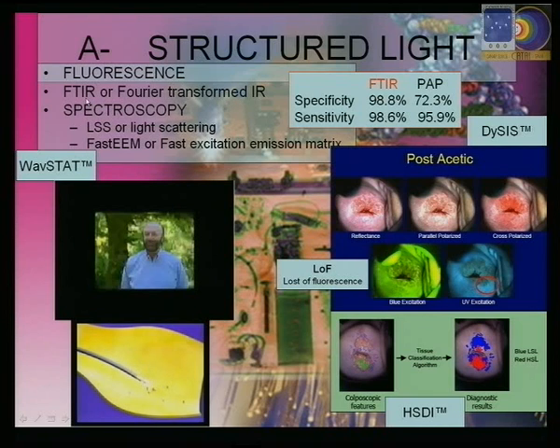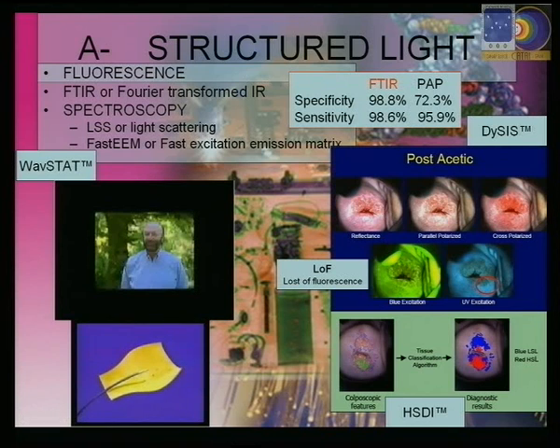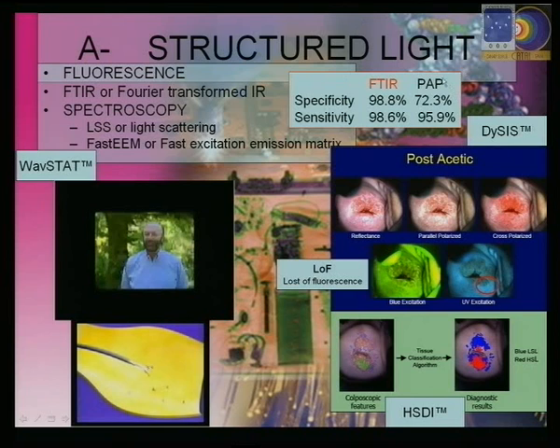This is a very classical use of spectroscopy for detecting malignant areas, and in the cervix and in the bladder and in the colon it does give better specificity and sensitivity than the visual and the histological and the cytological acquisitions.